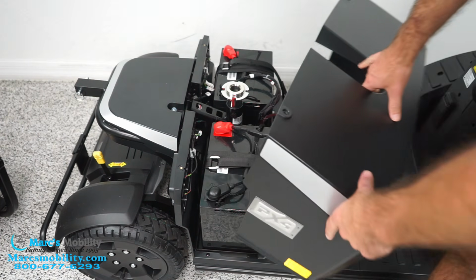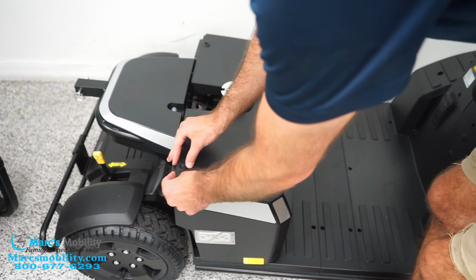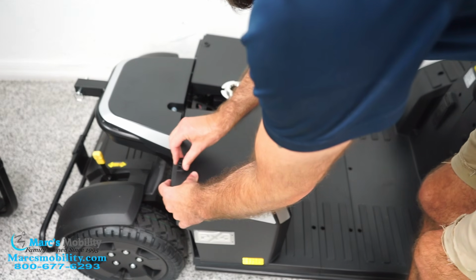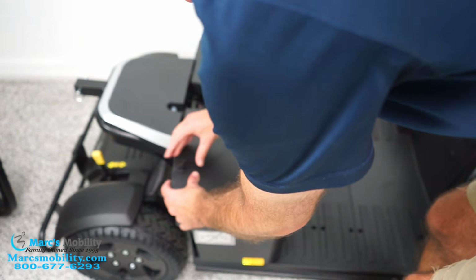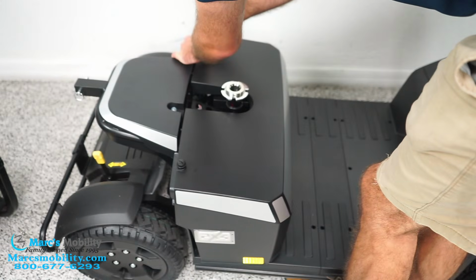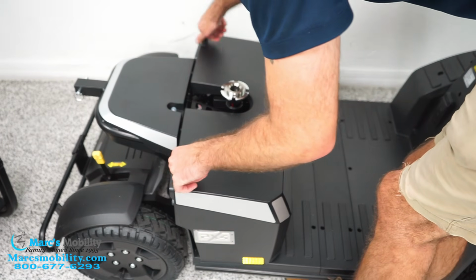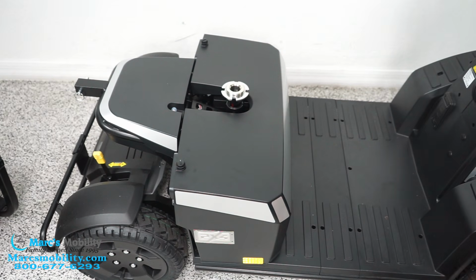Now we're going to put our cover back on. Goes on there like that. And then you want to line up these screw holes. There's one on each side. We'll tighten those up. Then we'll put our seat back on.